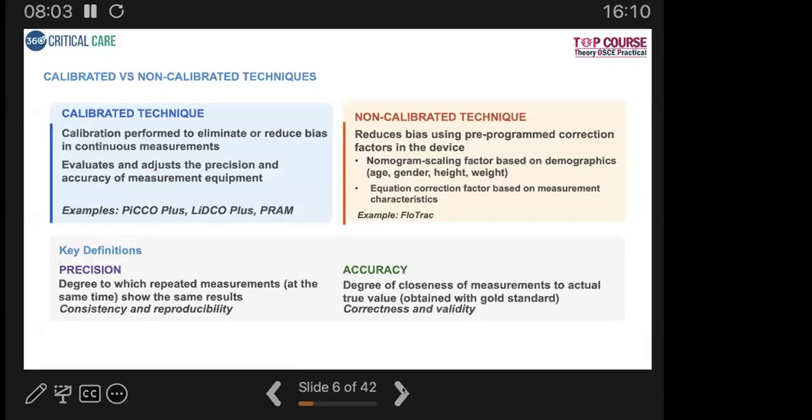So when the arterial pressure waveform based analysis can change because of various reasons, we cannot think that whatever is seen in the monitor is a correct value. So we need some reference value, a baseline value, to see whether the cardiac output measured is syncing along with the reference value, so that continuous monitoring can be reliable. So that is why we calibrate the devices.